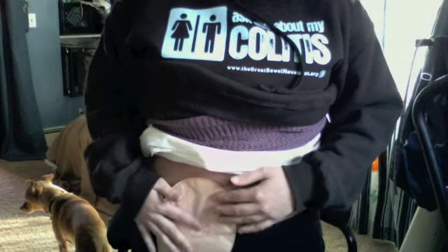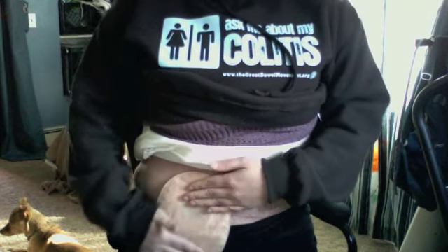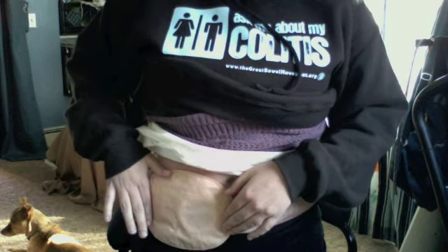So I was always running into these things of like, how can I hide this? How can I get it so it doesn't hurt me? If you wear regular jeans, a lot of times it'll cut it in half here, and then you have to push your stool down underneath your jeans band and make sure it's all down there so it's not catching up here. So this way, when you wear it sideways, you don't have to worry about any of that, because the band hits right below where the wafer is, and then you just push everything to the side.